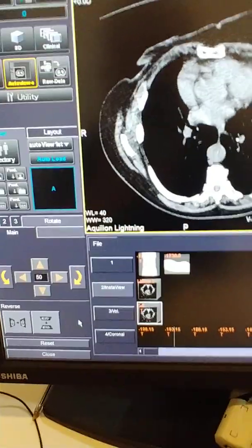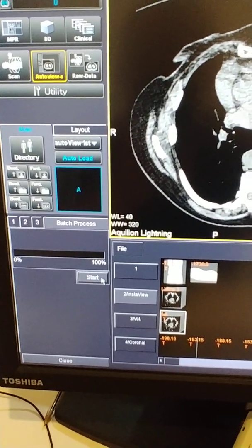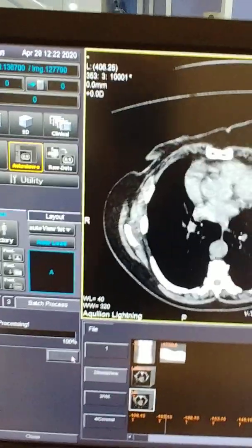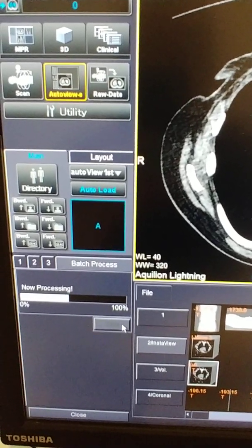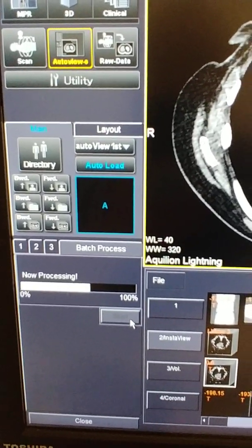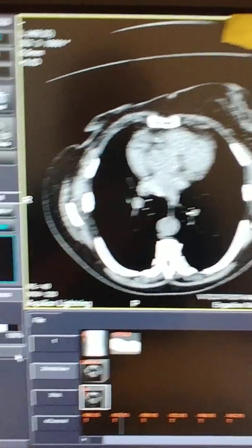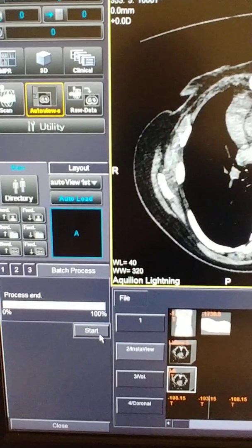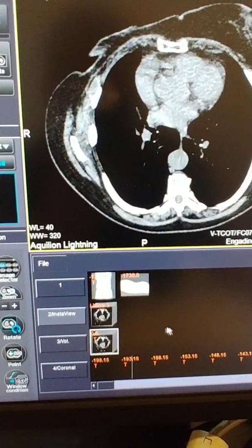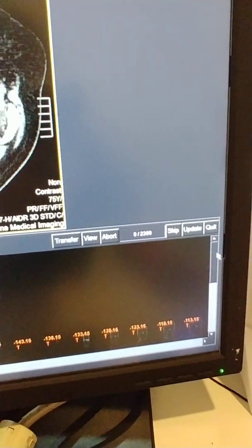Once we've done that, the next step is to close it, click on batch process in the corner, then click the start button and let it process. This takes a little bit of time. Once it's complete, we can close it.